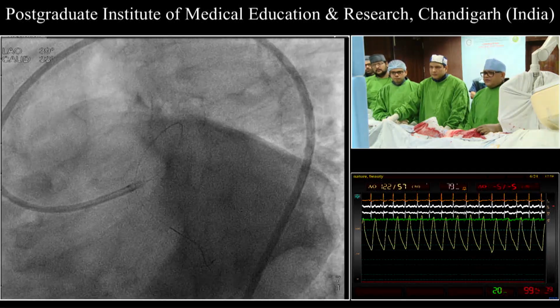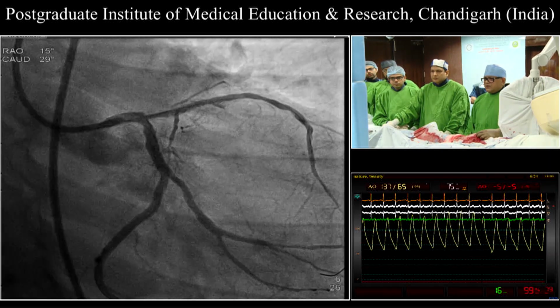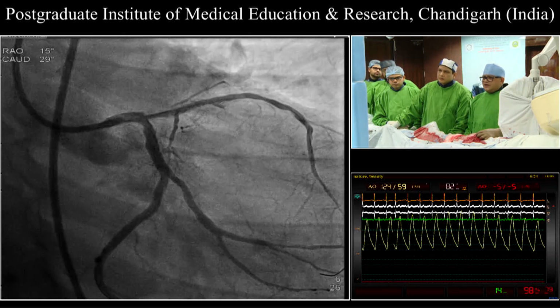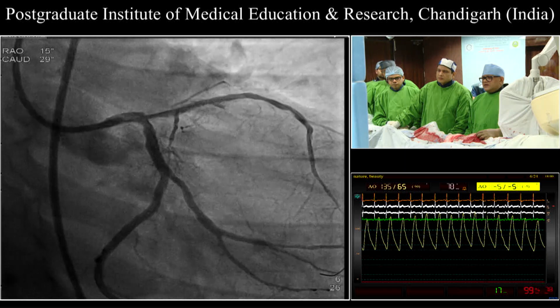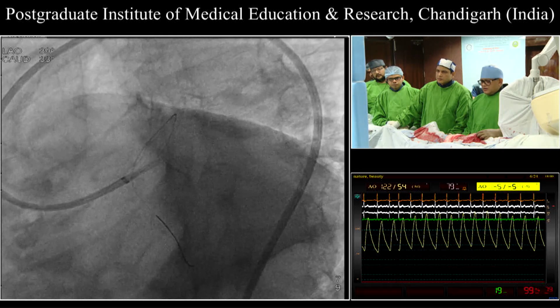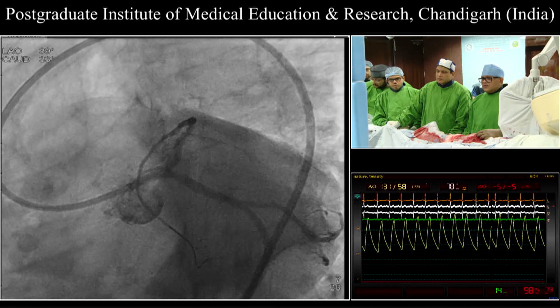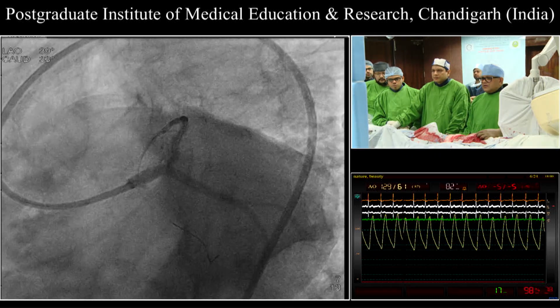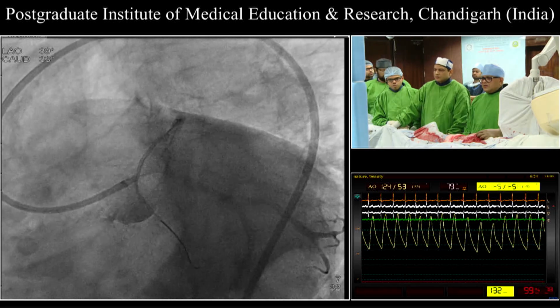So this is the spider view, and the previous one. Now the question is, should I go ahead with the ostial LAD stenting, or should I extend the stent to the left main as well? If I can comment from my personal experience, I always tend to cross over, especially in this situation, where some angiographic results also favor partial plaque expansion into the left main. I think it's more predictable, but I want to hear the opinion of the other panelists.